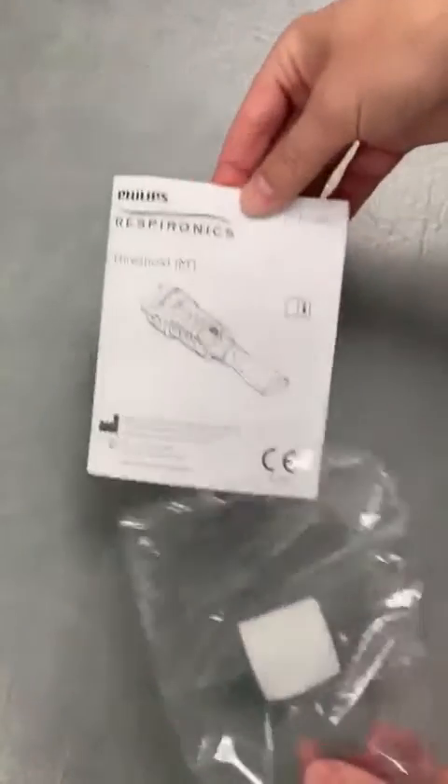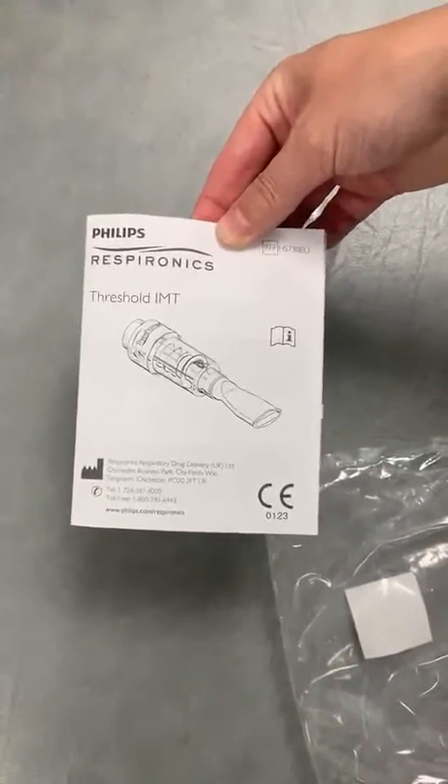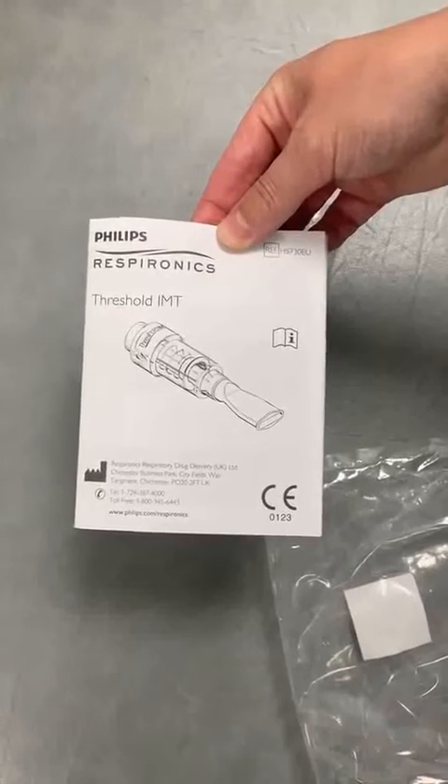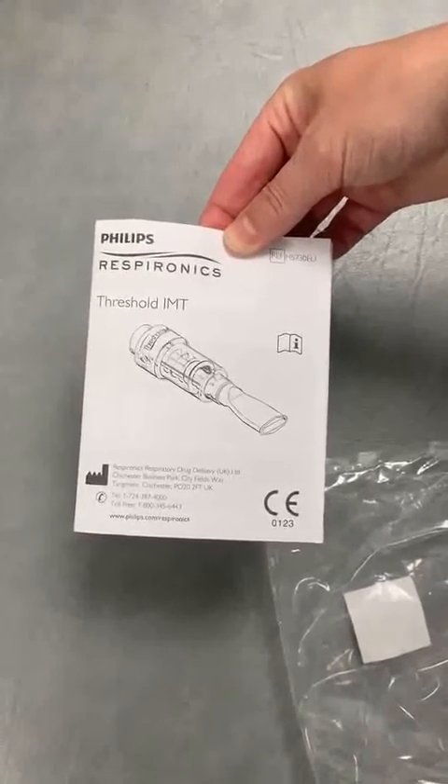Also in the packet is the instruction leaflet, which has a diary that the patients can use to record their training, and it also has all the cleaning instructions and the contraindications and precautions to treatment.